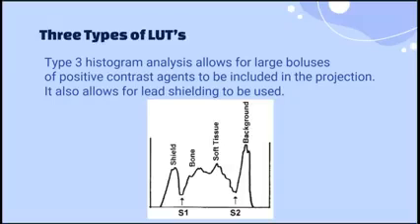Okay? S2 must also be identified during histogram analysis. So hindi lang si S1, dapat si S2 ma-identify din siya. And then all data outside these 2 points must be eliminated from the calculations used to produce the final image. So dapat this area here and this area here must be removed during image processing, okay, after ng histogram analysis, so that the image will only contain this area here, which is the bone and soft tissue for the abdomen.